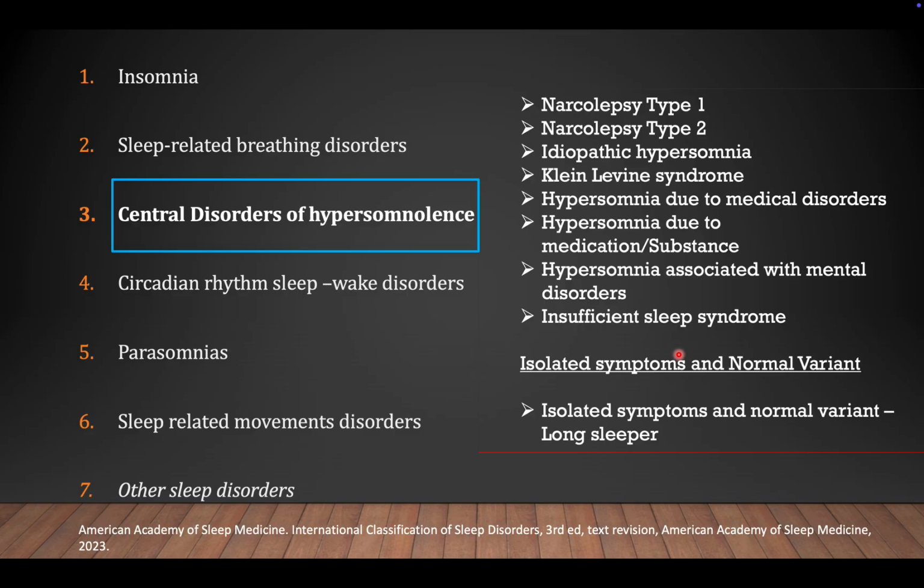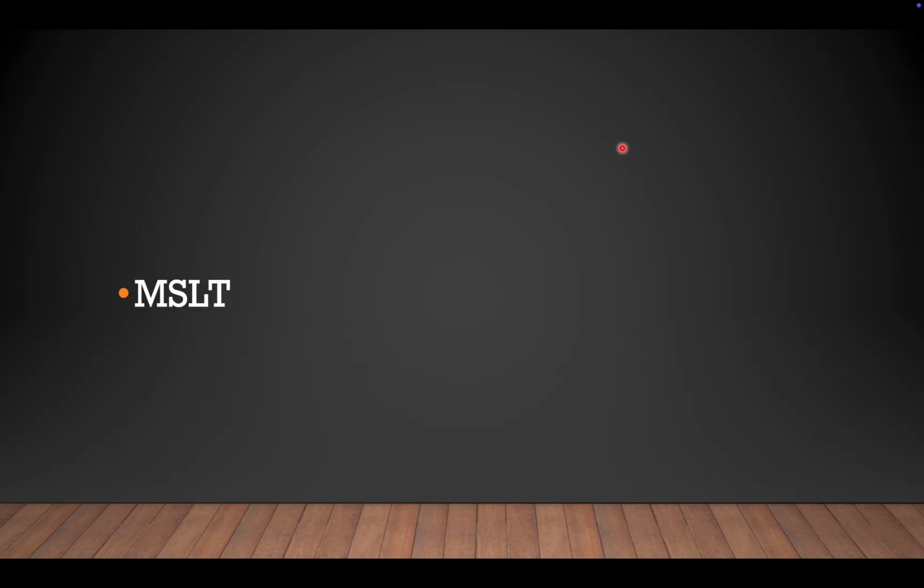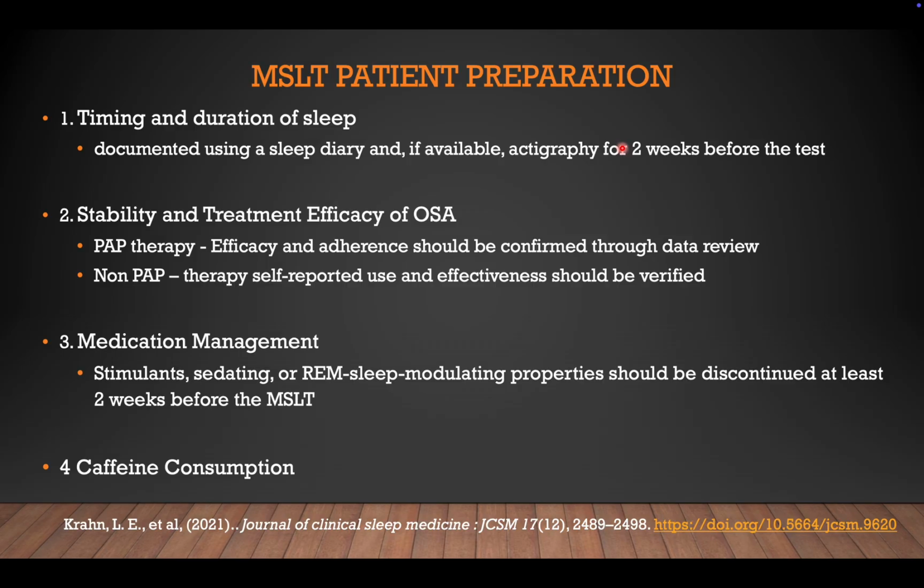So, what's happening is that the MSLT is generally used to diagnose or to rule out this central group of disorders. So when we are coming to the actual MSLT testing, the patient preparation starts way ahead. The results will be valid only if the patient is properly prepared. Without proper preparation, the test results can be misleading.